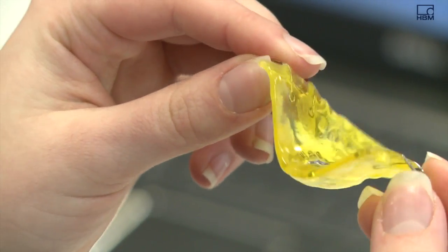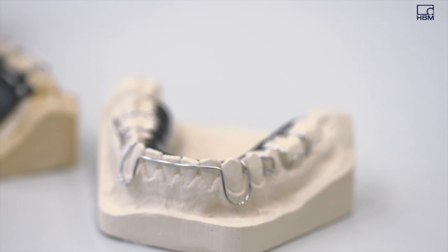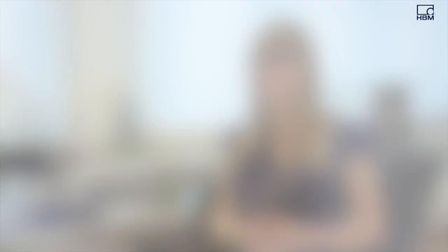These braces will provide precise data on the force being applied to the teeth. This force will vary over the period of time the braces are worn. As a result, the braces will loosen from the teeth and will no longer do their job of straightening them. To correct this, the expansion screw in the braces has to be tightened to increase the force applied.